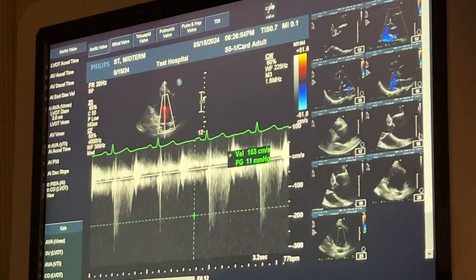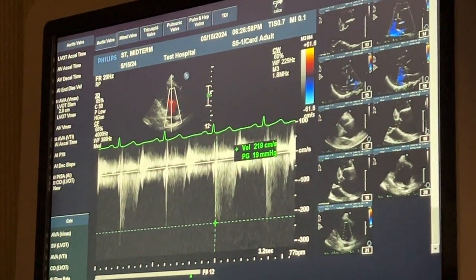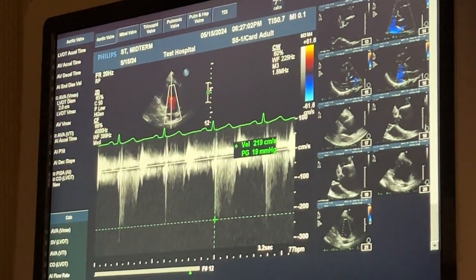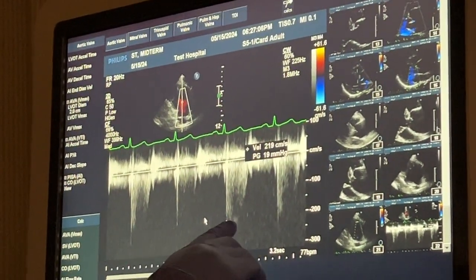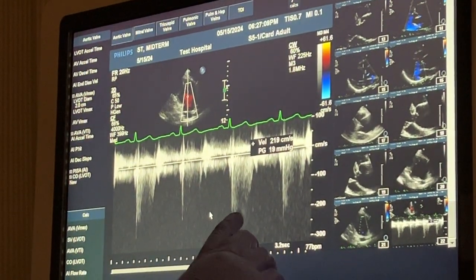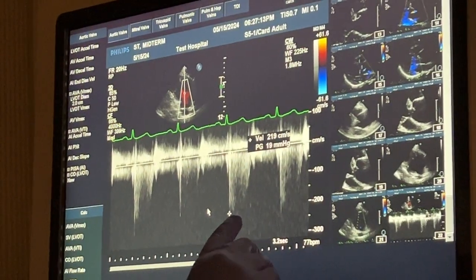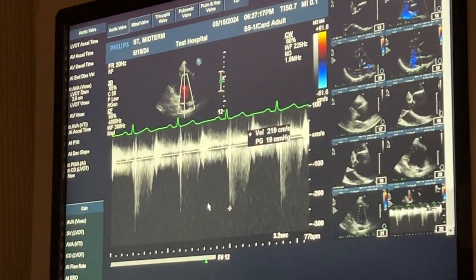So I'll just put a caliper where I see the max, but you guys don't have to do that. For your TR pictures, you're just showing it essentially. It's the inflow velocities that we'll be tracing VTIs of. But I'll just show you, if you do see a little envelope, you can put a caliper at the peak where you can see it. I wouldn't put it here because that's imaginative. I don't actually know it's there. I can assume that that's the direction that it's going, but I can't actually see it.